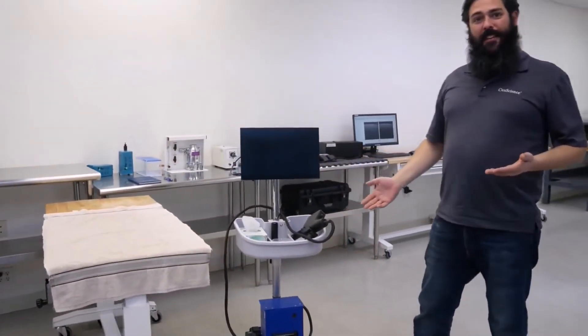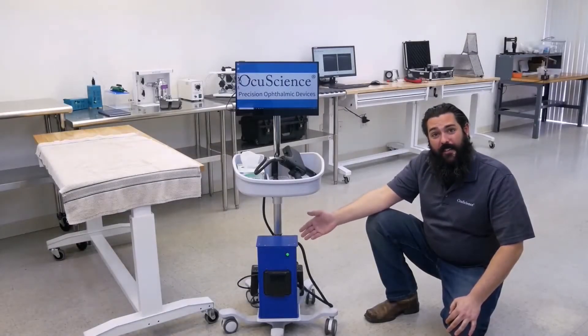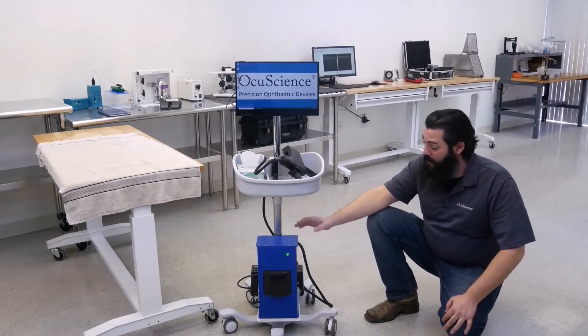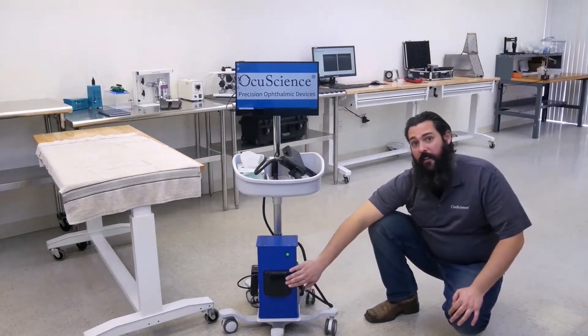This here is our VET OCT. Let's take a look. As you can see, it's very small — it's about the size of a shoebox, weighs less than 10 pounds, and houses a very powerful i7 computer in it as well.